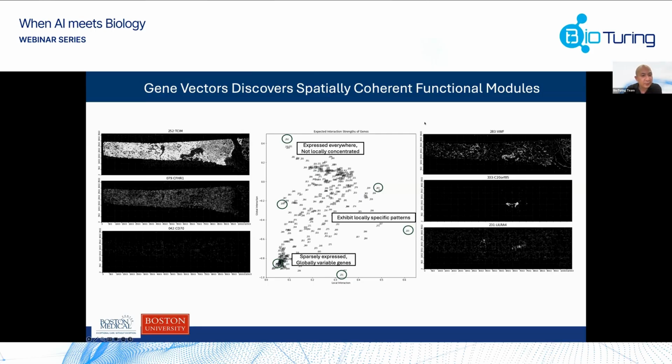So the question is, how about doing interactive data alignment for TMA arrays? Yeah. Well, you can do it just as a normal tissue, but what we have seen sometimes is that you almost have to cut and paste the individual cores and then align them one by one, because sometimes there are just differences. It also depends on which section it is, whether it's right adjacent, or sometimes a little bit further.